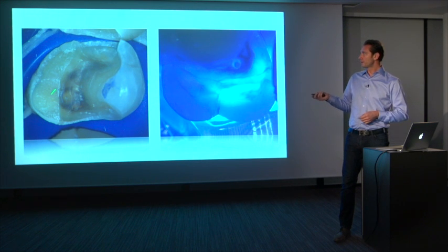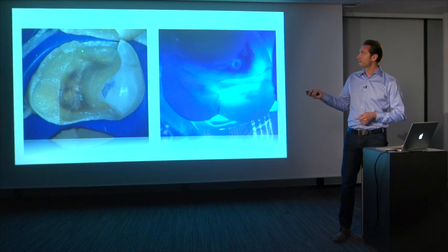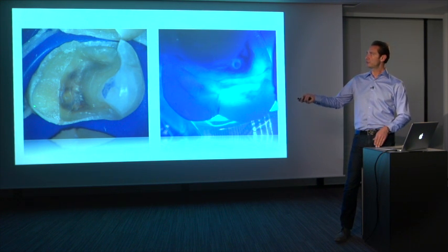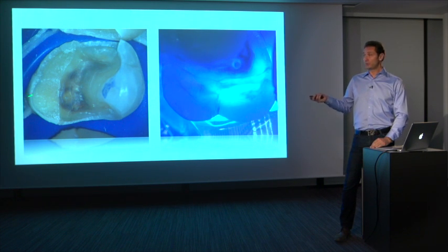As you can see, the final fracture here was created by just pushing this wall to the buccal. The fracture was complete. The only thing that prevented final fracture was a small connection on the enamel side. Unluckily I don't have pictures of that, but from the inside you could see a white line really showing that the crack was through and through the cusp. This needed to be removed anyhow.